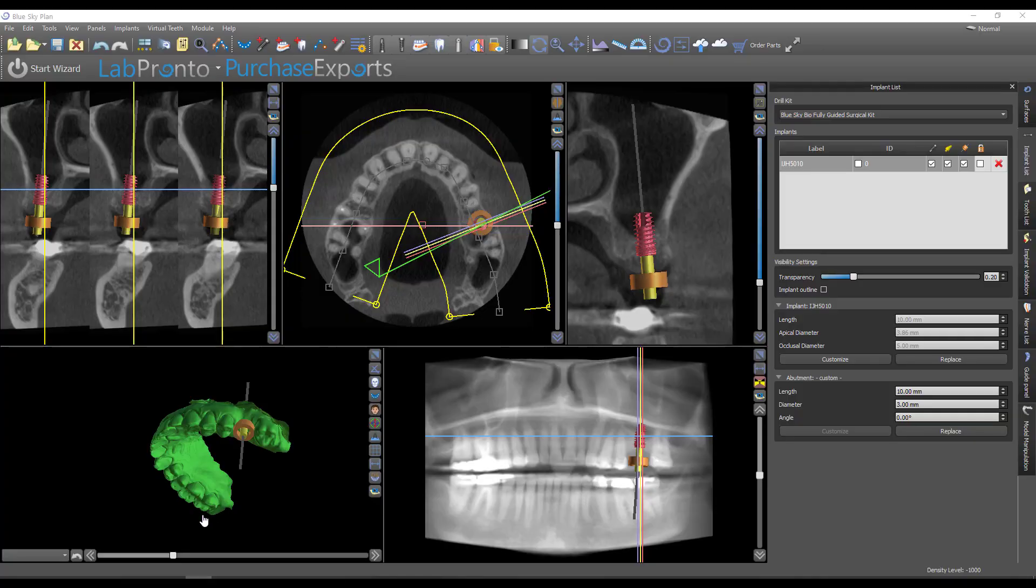Hey, this is Dr. Corey Glenn with BlueSkyBio, and I'm going to show in this video how you can import a post-operative CT once the implant has been placed into your pre-operative planning so that you can compare the plan versus where the implant actually came out.